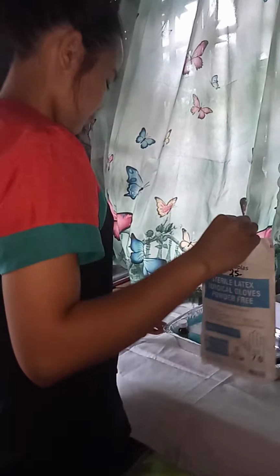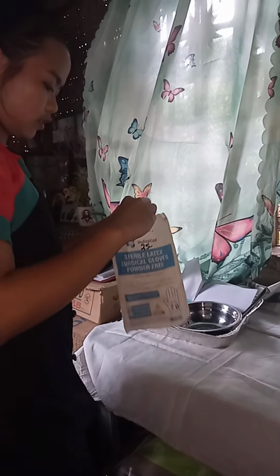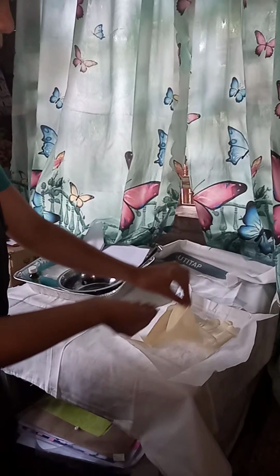Then, it is the time to apply the sterile gloves. Make sure to touch this side, 1 inch, to maintain the sterility. It also has 1 inch. Make sure to touch this area only. Then, apply it.